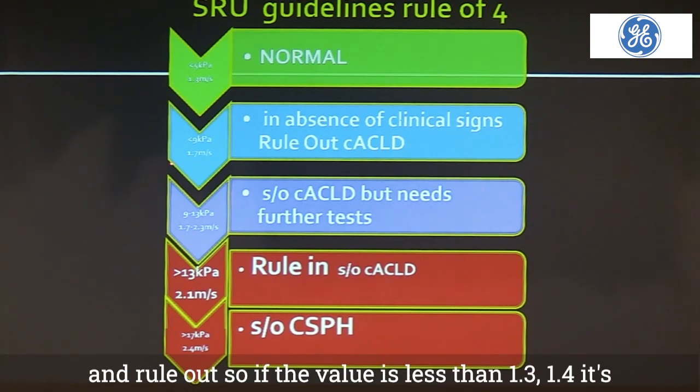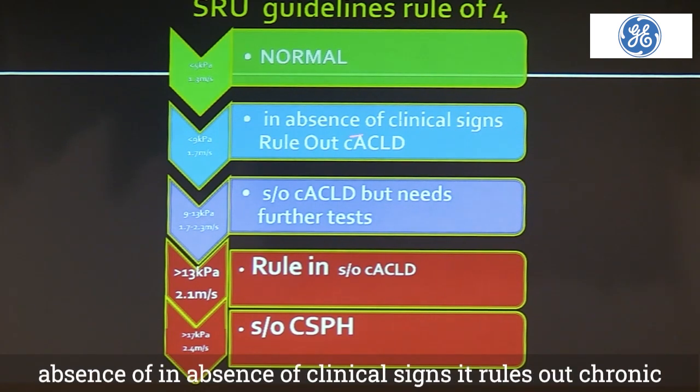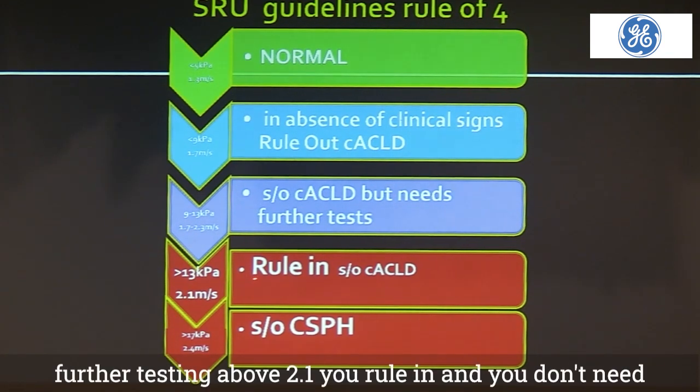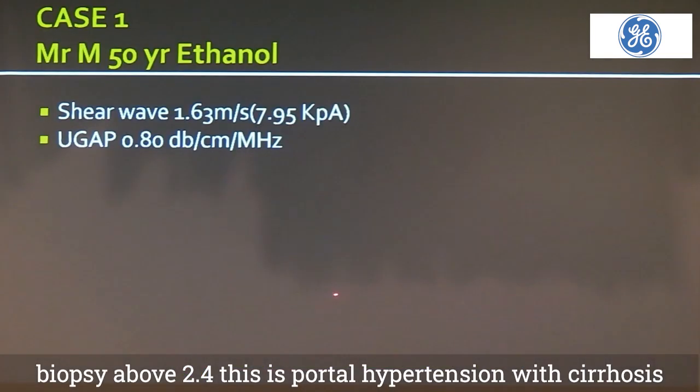If the value is less than 1.3 or 1.4, it's normal. This is the SRU guidelines. And if it's less than 1.7, in absence of clinical signs, it rules out chronic liver disease. Above 1.7 to 2.3 needs further testing. Above 2.1, you rule in and you don't need a biopsy. Above 2.4, this is portal hypertension with cirrhosis.